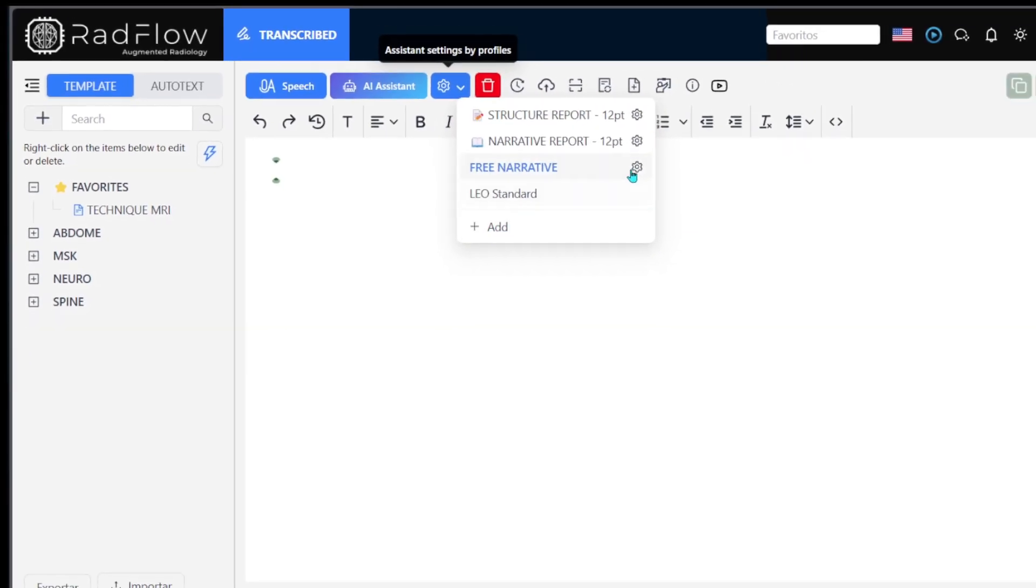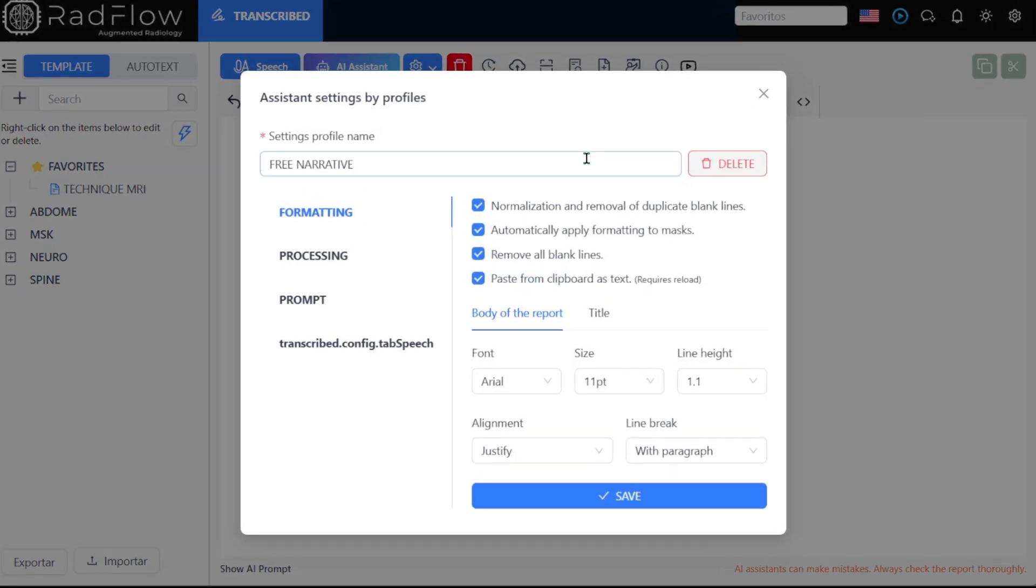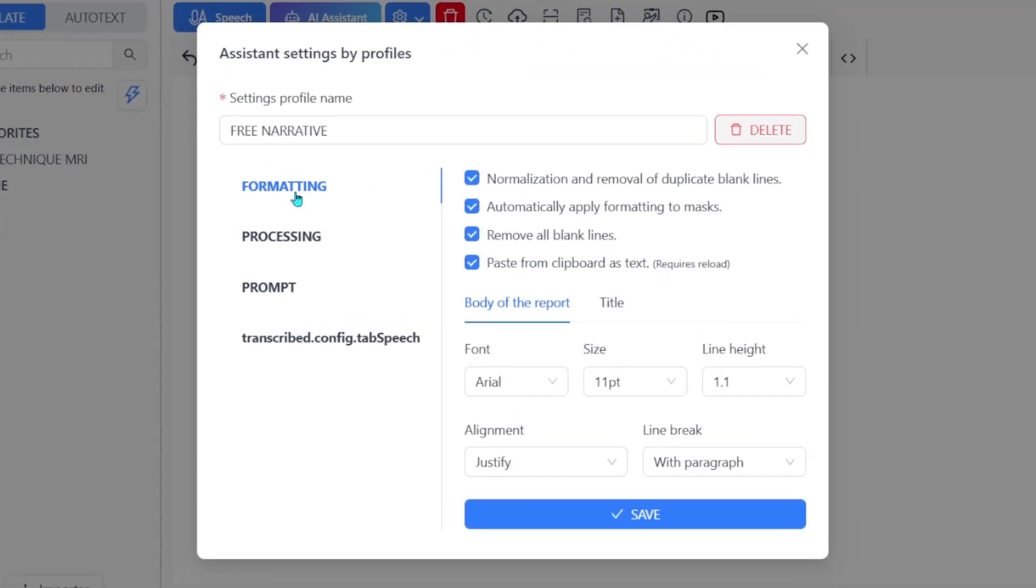In the Formatting tab, you can choose your preferred formatting options. Select the font, font size, and line spacing.